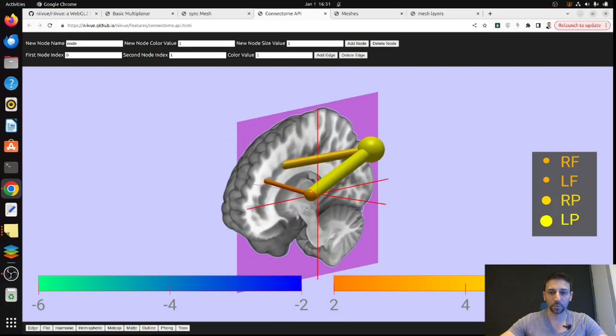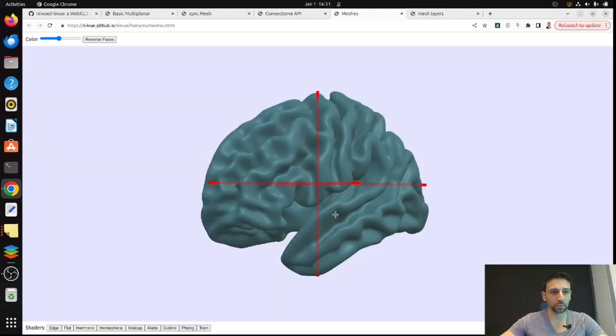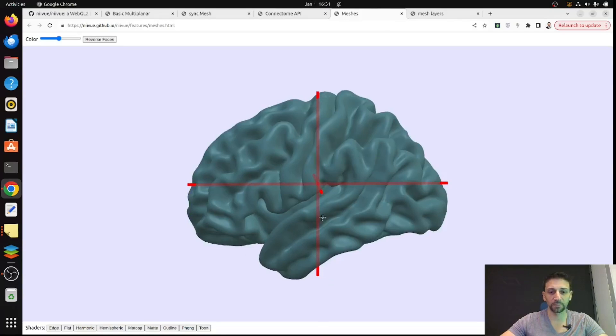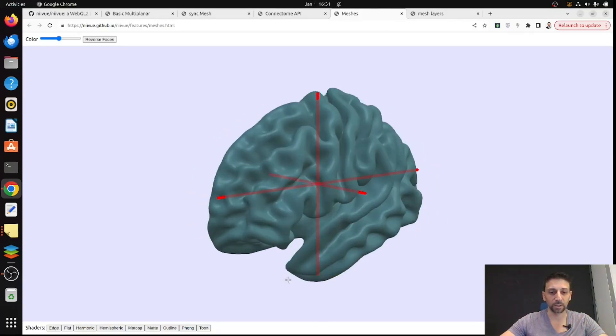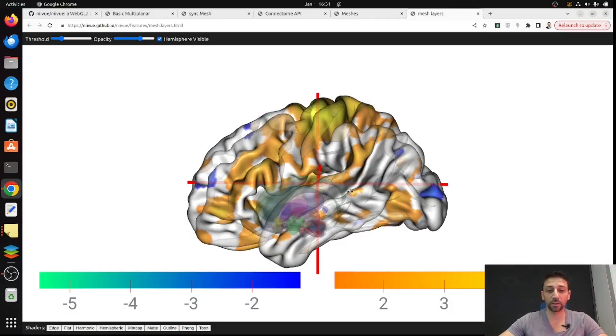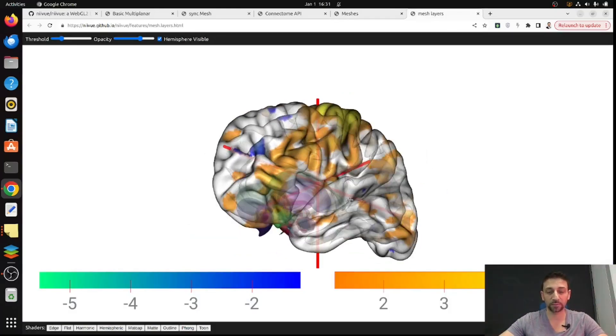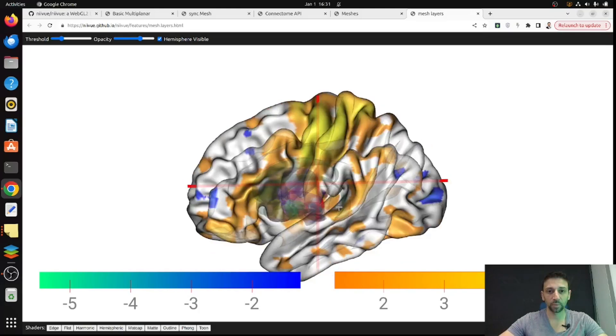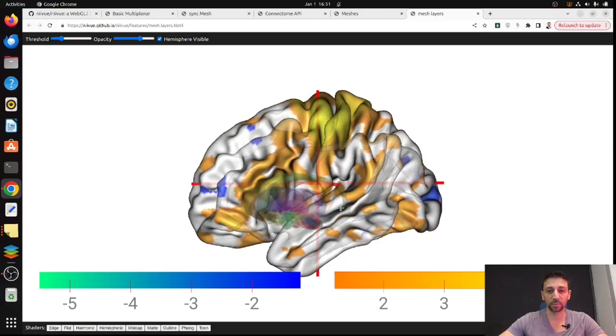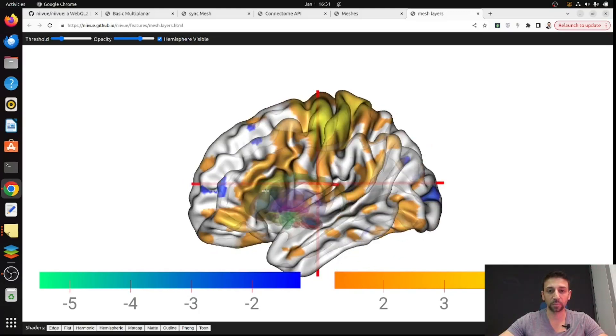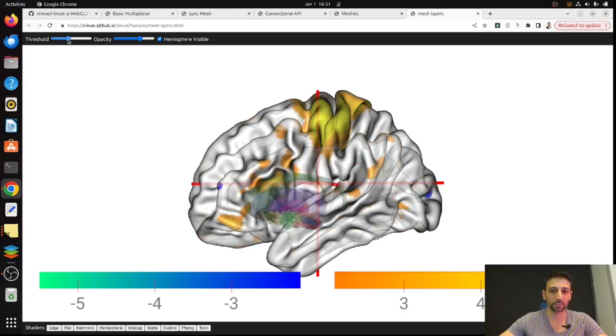The mesh can be very shiny and you can also change the level of the type of rendering of the mesh. You can also connect the activation maps like from functional MRI, which I found interesting. Apart from the fact that it's overlaying with some kind of atlas and mesh, you can also decide where to threshold the values.